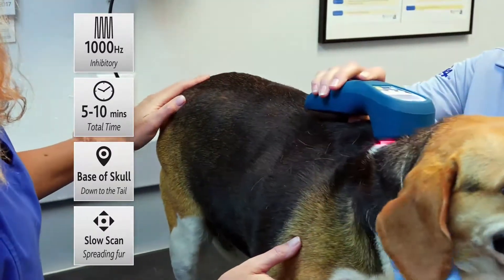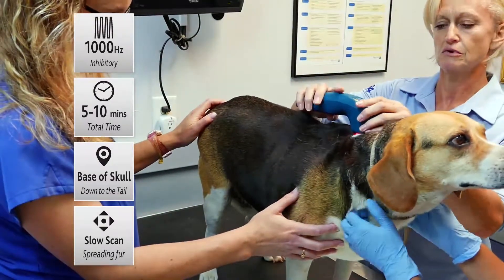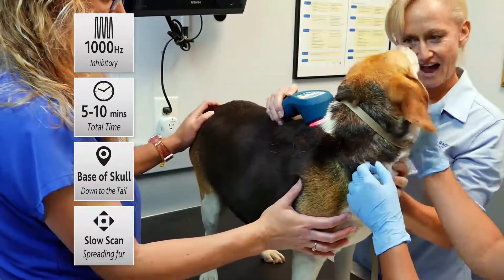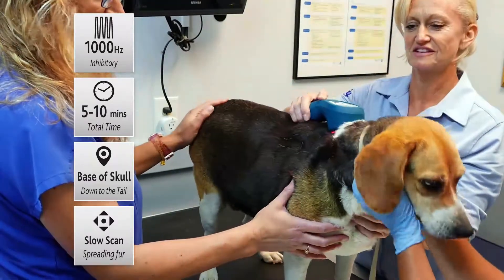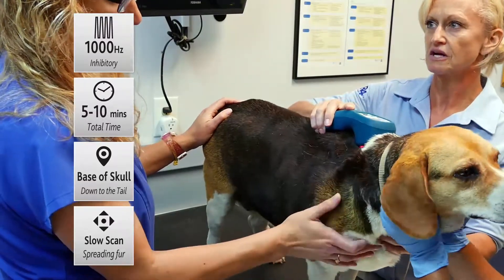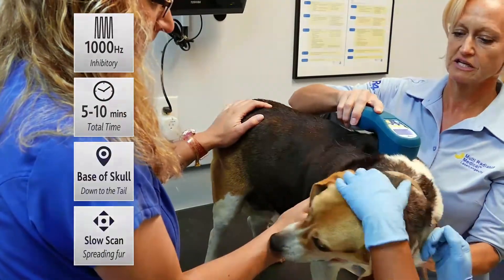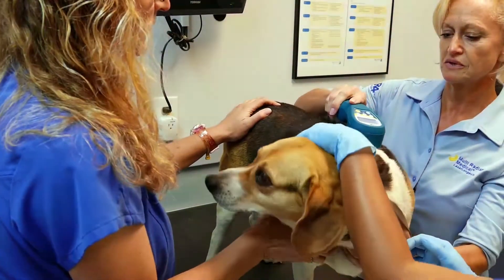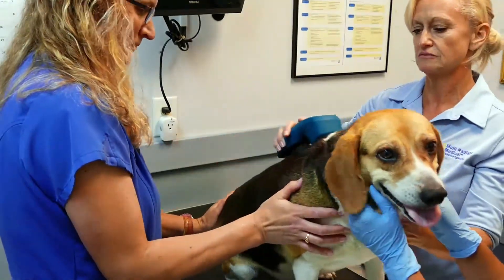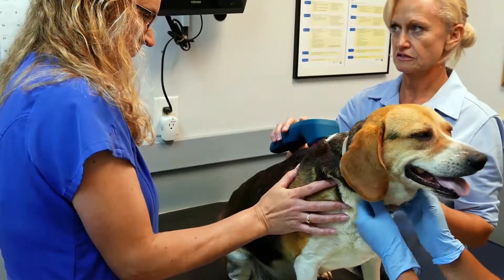I'm actually going to work down her spinal column, but it's just off to the side. It's hard to feel in this little chubby bubby here, but just off to the side of the spine. That way it's easy for the light to get through the vertebrae and stimulate the release of the serotonin. I tend to stay in each spot for about 10 seconds, that way it at least gives it time to get through the tissue and really stimulate the release of serotonin.